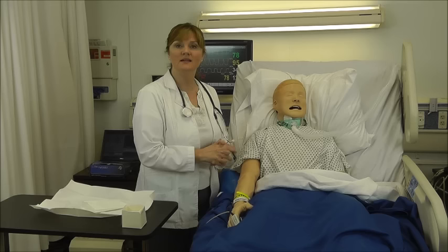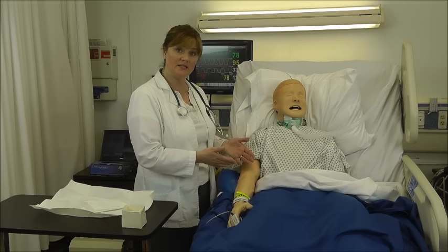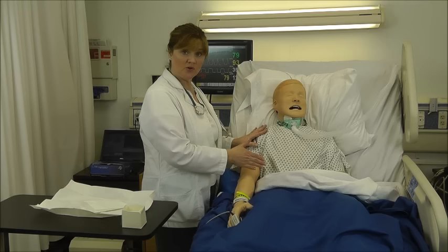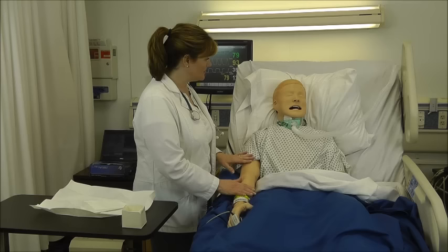Now I need to do my post-procedural assessment. That includes checking his respiratory rate, and that now has come down to 18, rechecking his pulse oximetry reading, that now has gone up to 98%, and I need to check his effort, his respiratory effort, and auscultate his lung sounds anteriorly and posteriorly. Mr. Simon, I'm just going to lower your gown so I can listen to your lung sounds again.